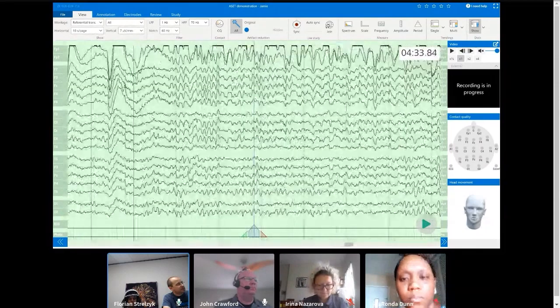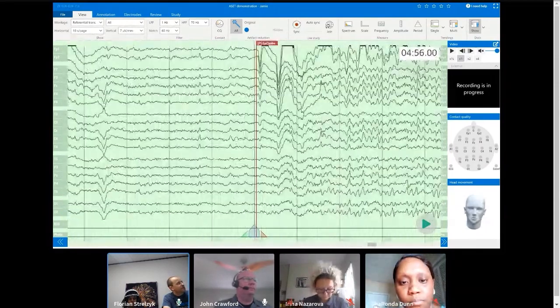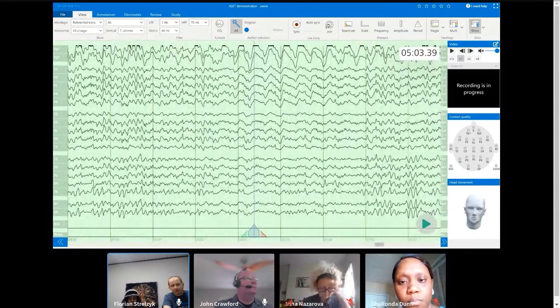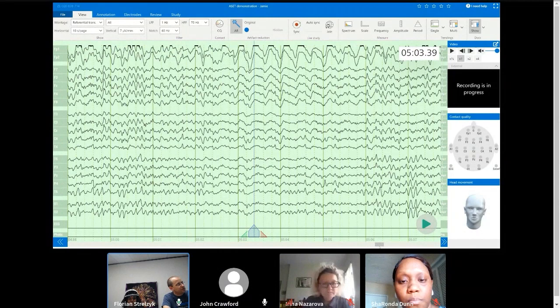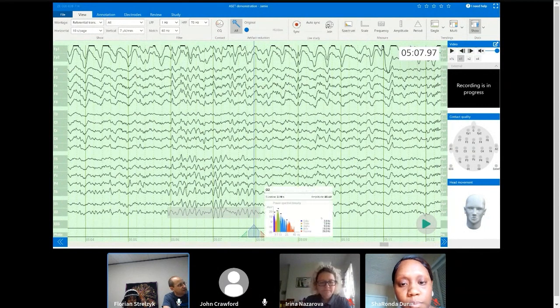But I think by the time we were at the 5-minute mark, here she closed her eyes. Now what I saw her do is, when you close your eyes, they were kind of moving. I saw that. Yeah. And so we see there's an FP1, FP2 here. But regardless, we see some slowdown in the back. So let's look at that. So just what we would expect.